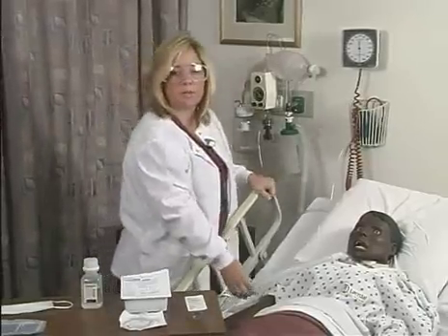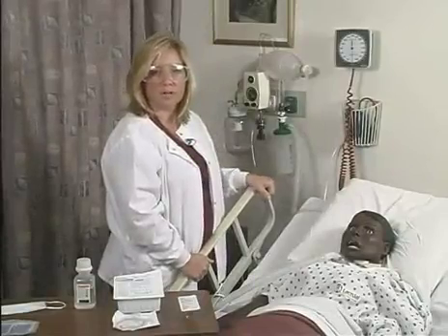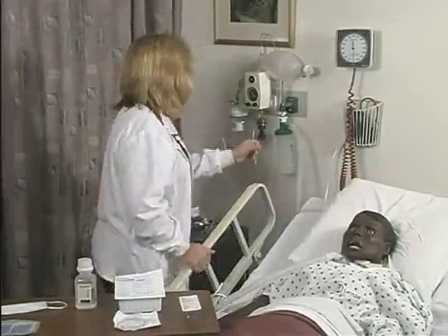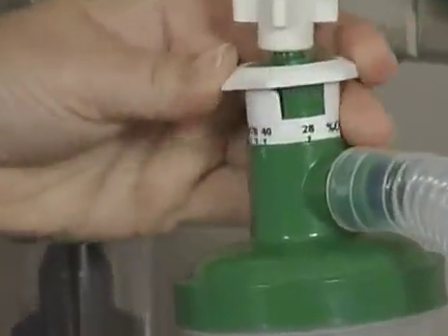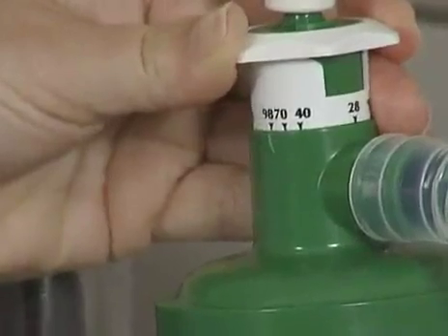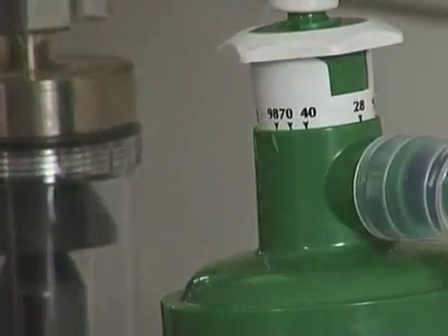The next thing I'm going to do is adjust the FiO2 to hyperoxygenate the patient prior to the suctioning procedure. I'm going to place the patient on 100% oxygen for a few breaths prior to suctioning, or a minimum of two minutes.